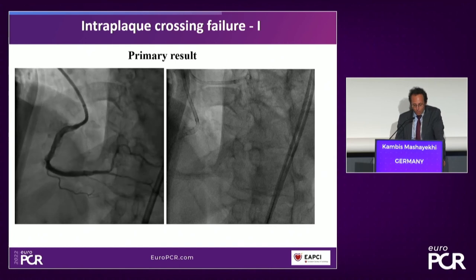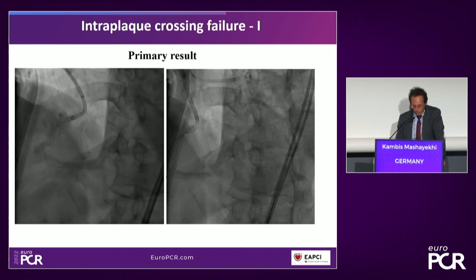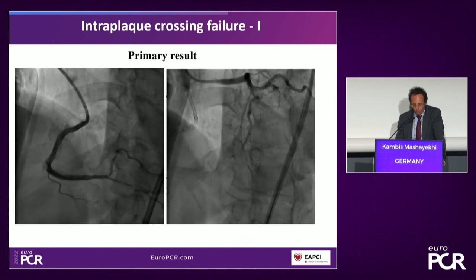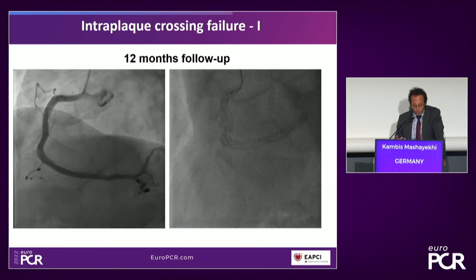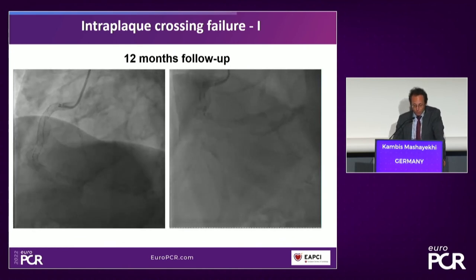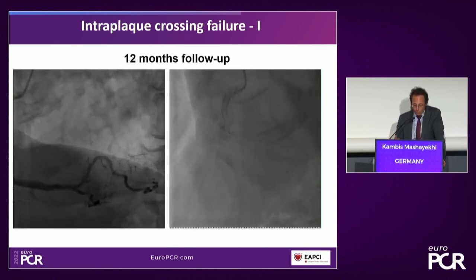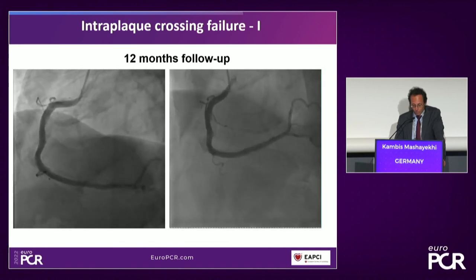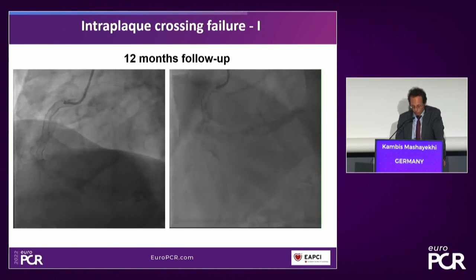Well, we always had some concerns in the past. Does it work in the long term, regarding long-term outcomes? But here you see even the 12-month outcomes, and they are compared to the RESISTANT. What the RESISTANT data shows us is that when you go around calcification, as long as your landing zone and your runoff is good, and you have a great reconstruction of the anatomy of the bifurcation, as you can see here, the long-term result is quite good.